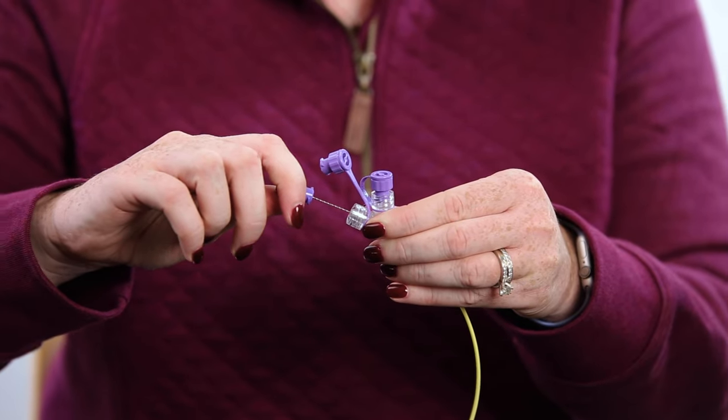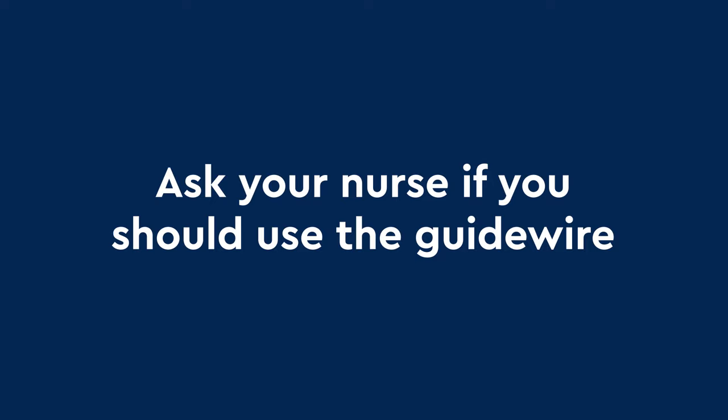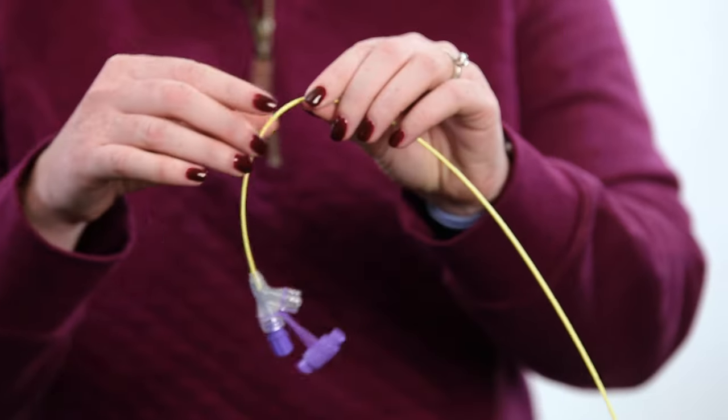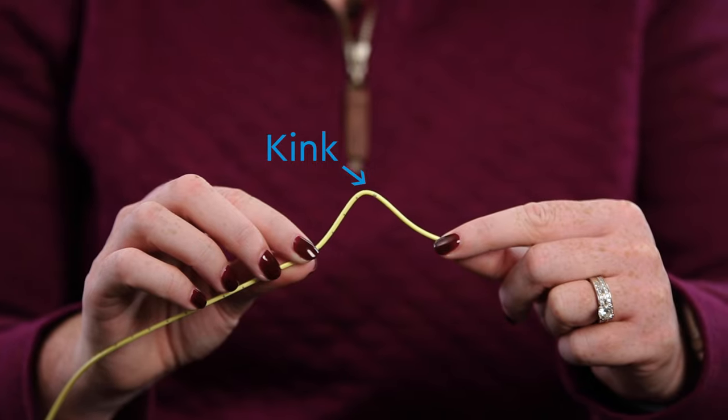Keep the guide wire in the NG tube. Ask your nurse if you should use the guide wire when placing the NG tube. Then check the tube for cracks, tears, or kinks. This is what a kink looks like. If your tube has a kink, use a new tube.